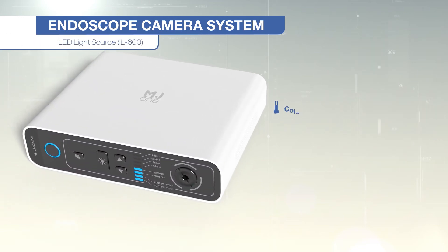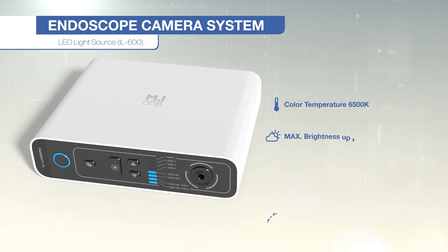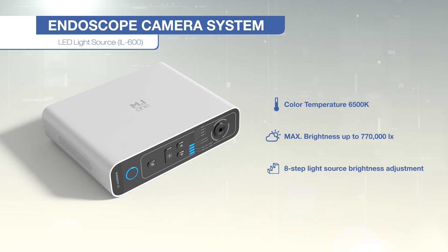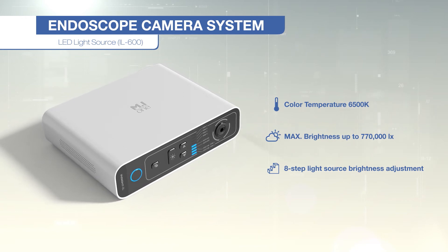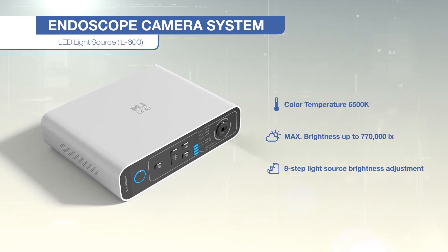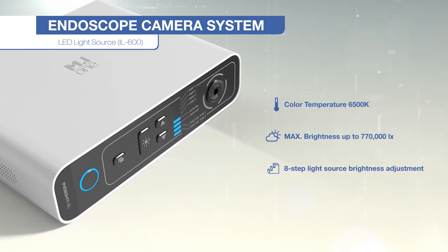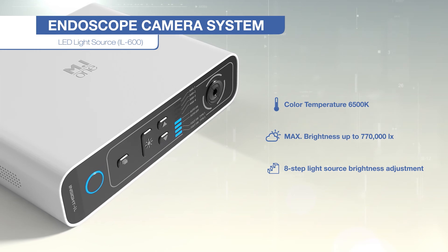The IL-600 is a light engine made of optical fiber that illuminates an affected area with a high-output cool white LED source, by connecting the source to a rigid endoscope. It has a user-friendly operation, simple design, and is compatible with optical fiber.